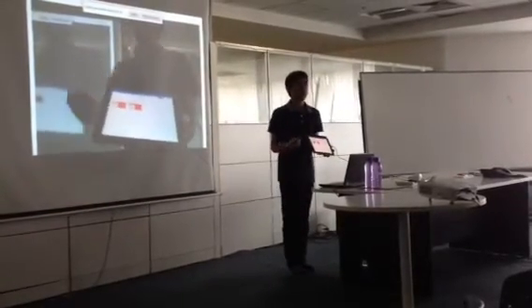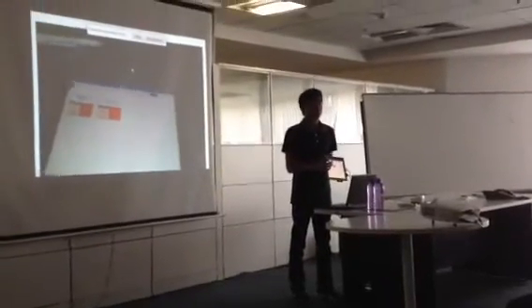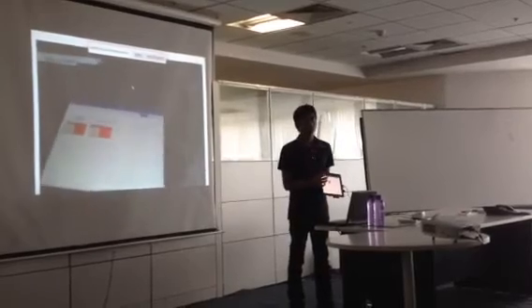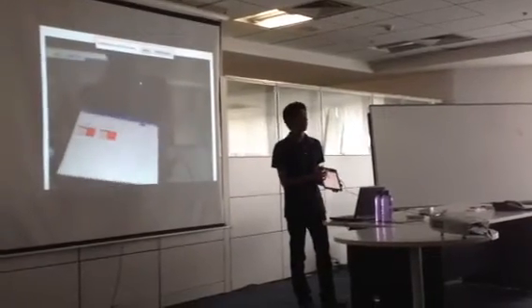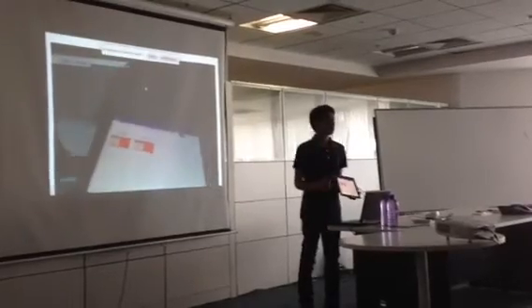So what you can see on the reporting view are the patients that have closed cases and the reports are available. The top part has the patient's name or alias, and this display changes depending on what the clinician has permission to see. If the clinician has permission to see the full name, you'll see the full name, otherwise you'll see just the alias.